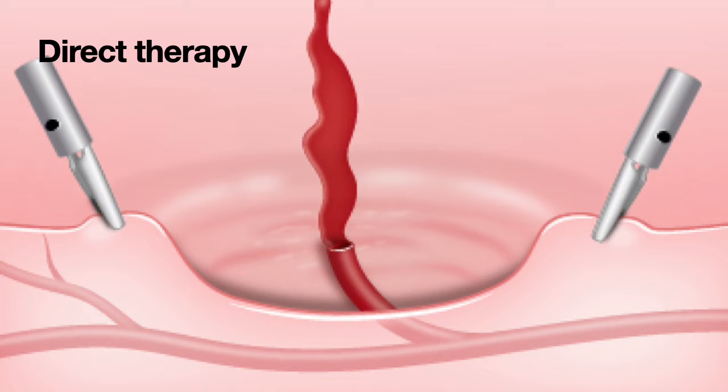You could assist the interventional radiologist by placing a clip close to the site of bleeding, like you've seen here. These clips are visible on fluoroscopy, and the interventional radiologist could direct the catheter embolization to the vessels that are near the clips.